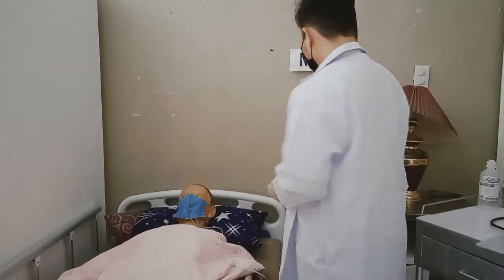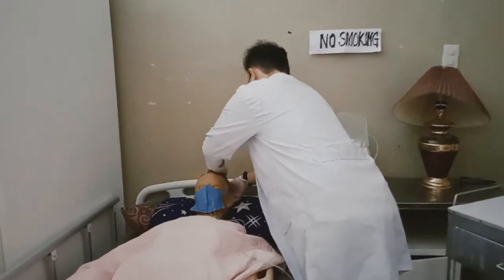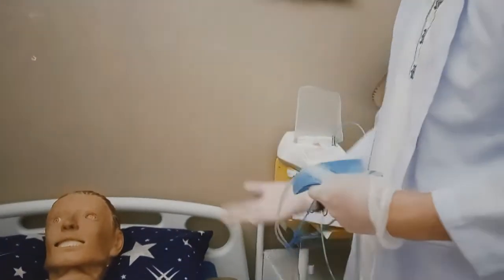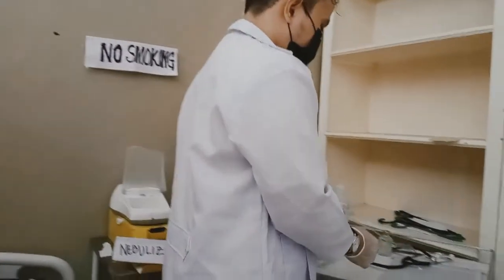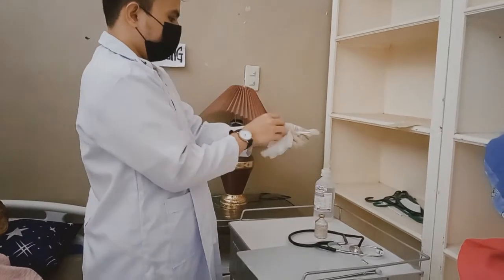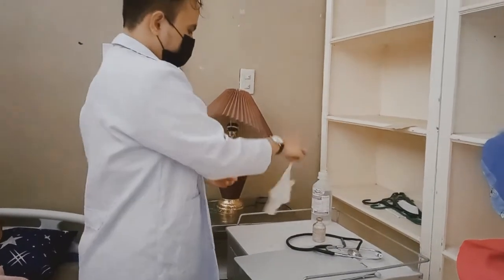Have the patient gargle and rinse with tap water after using the nebulizer as necessary. Clean the nebulizer according to manufacturer direction. Remove gloves and additional PPE if used. Perform hand hygiene.